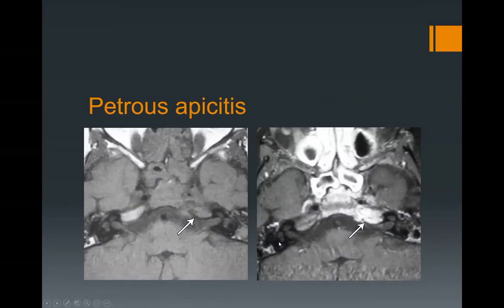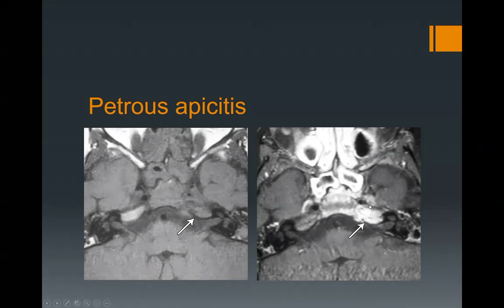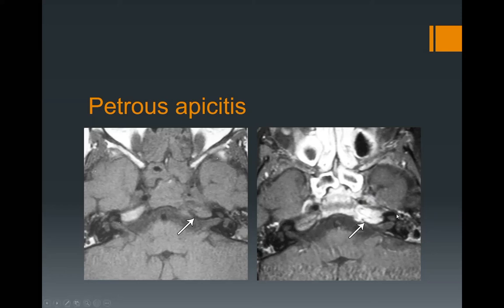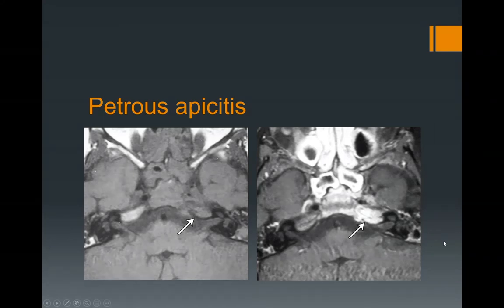When you have petrous air cells, you can get petrous apicitis. Here you see abnormal T1 signal intensity compared to the opposite side, with enhancement on post-contrast images, dural involvement, and involvement of Meckel's cave and cavernous sinus on the left side. These patients may present with a sixth-nerve palsy — that would be Gradenigo syndrome. With extension into Meckel's cave, patients could also present with fifth-nerve symptoms, and even seventh-nerve symptoms due to the facial nerve traveling on the floor of the middle cranial fossa.